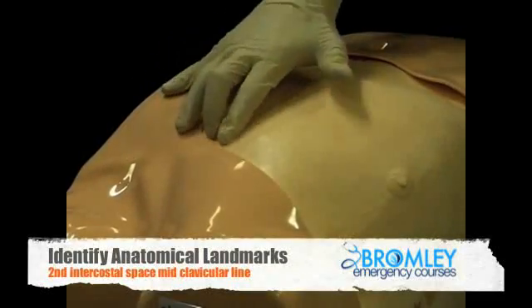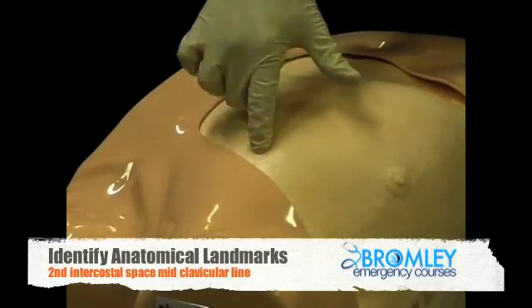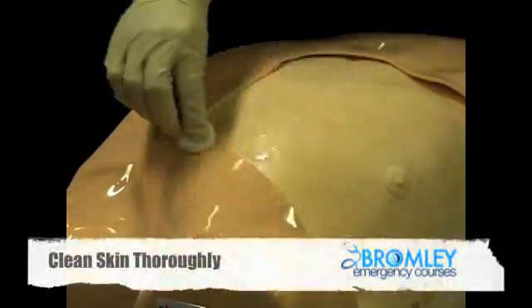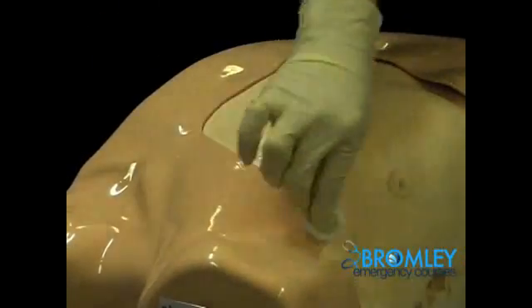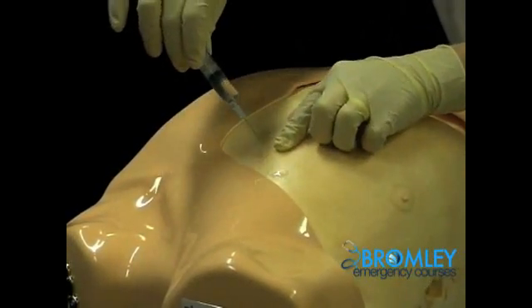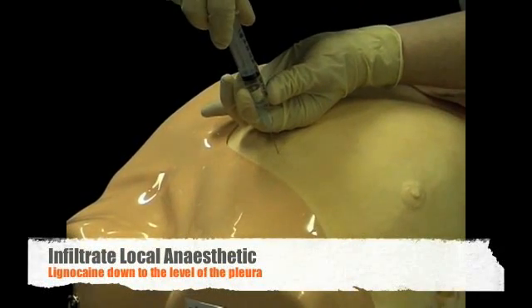Begin by identifying your anatomy and cleaning the area. Next, infiltrate local anaesthetic down to the level of the pleura.